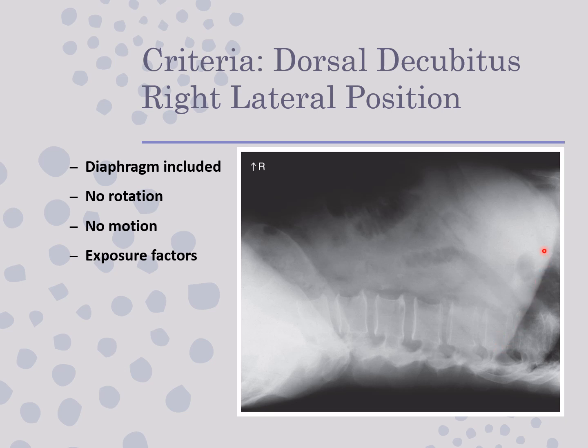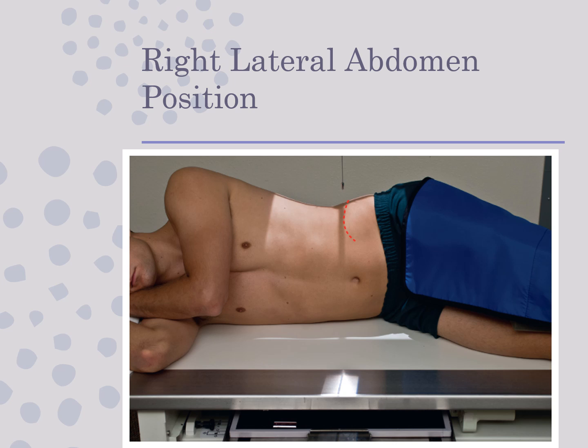We're supposed to demonstrate bilateral diaphragm. Now, I do see it here, and I see it here, but honestly, this is cutting it a little bit close. The picture in the book is the same exact one, so I feel like it's pretty close on that. They could have, and they very well might have, just cropped this for purposes of the book, but you should be able to visualize more of the diaphragm on this, and the anterior surface of the patient, the top up here. You should definitely be able to see the top of the patient since air rises.